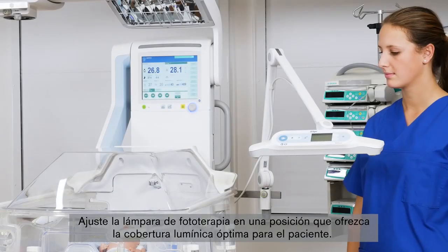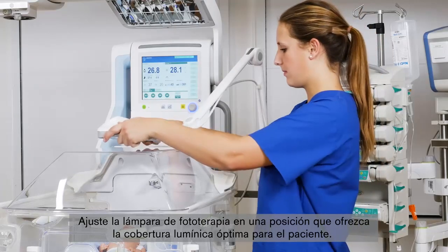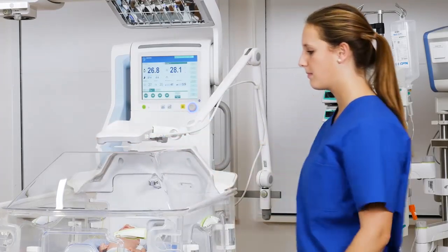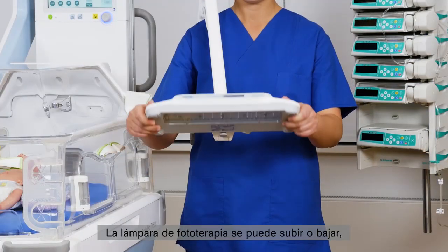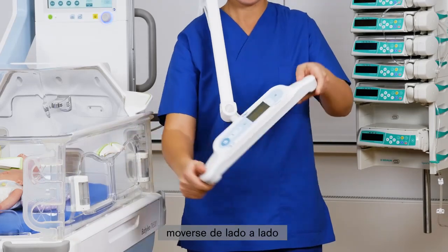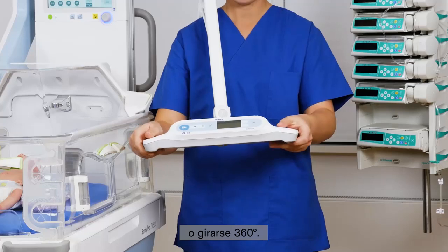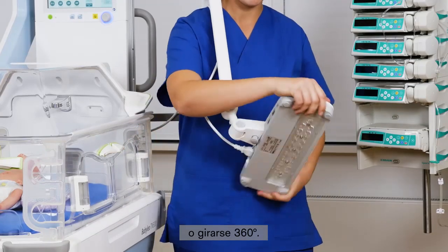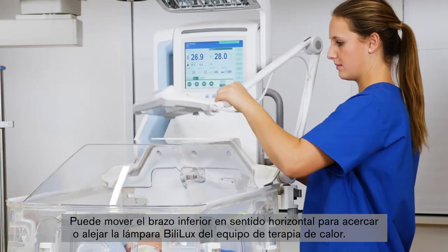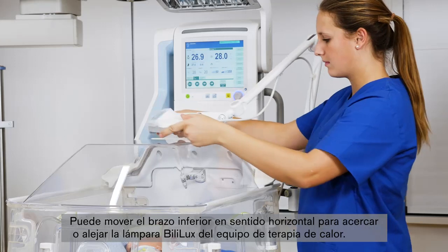Adjust the phototherapy light to a position that will provide the optimum light coverage to the patient. The phototherapy light can be moved up or down, side to side, or swiveled 360 degrees. You can also move the bottom arm in the horizontal direction as needed to bring the Bililux closer or further away from the warming therapy device.